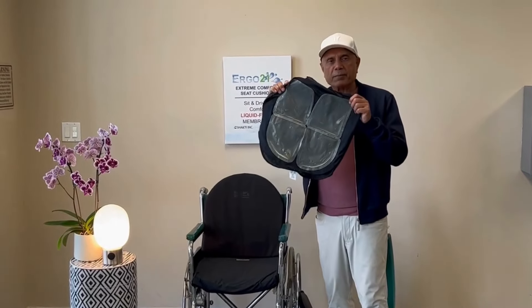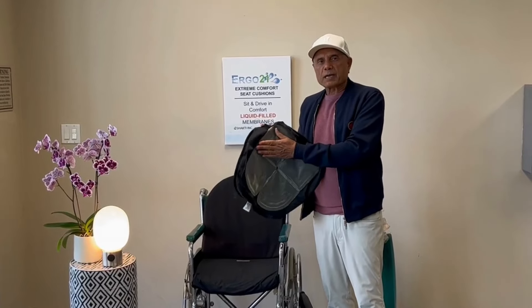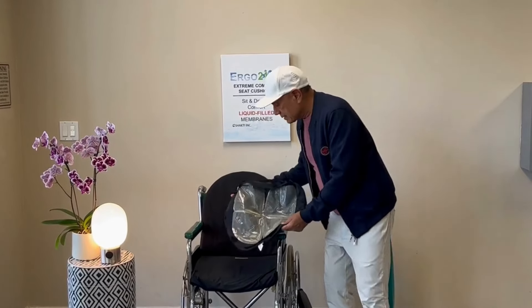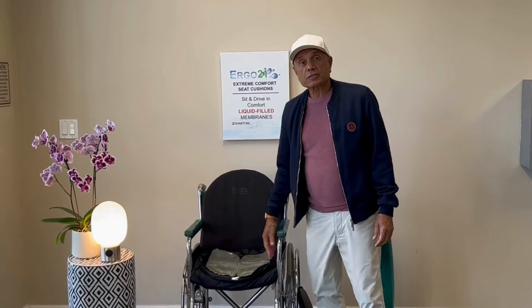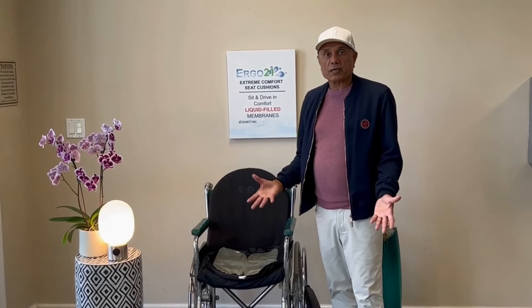All our cushions have the liquid film membranes — it's called Liquicell. Liquicell keeps the blood flow under the tailbone and thighs, so it helps with pressure sores when you sit 12 hours a day in a wheelchair or you're driving.